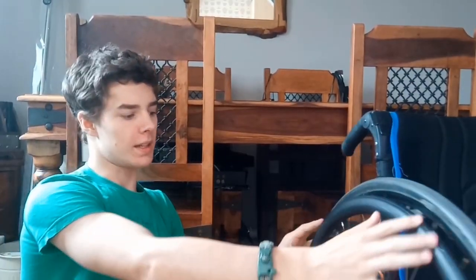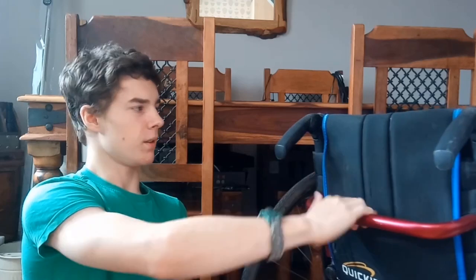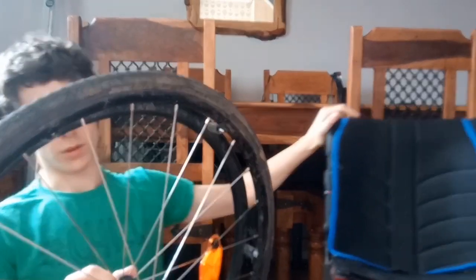And now we're left with a pretty bare frame, if I just do that. Now you can also take off the wheels, which I will do in a moment, and you can obviously fold this down, but I don't think I'm going to need to. I don't need to adjust anything back here. Might just give it a good clean. Yeah, that's everything that you can take off, obviously, other than the wheels, which I don't need to take off just yet, but since I got it off, actually, I might as well do it now.